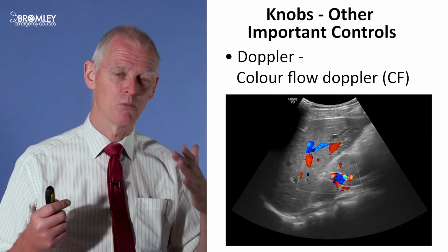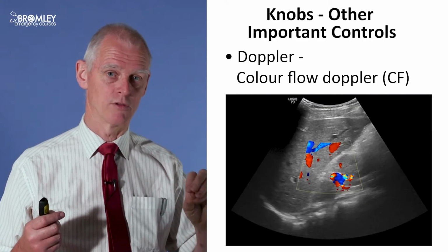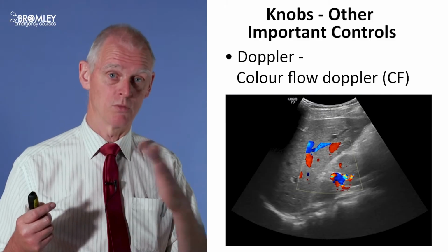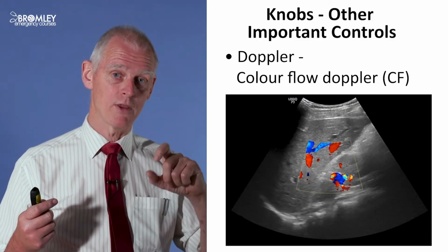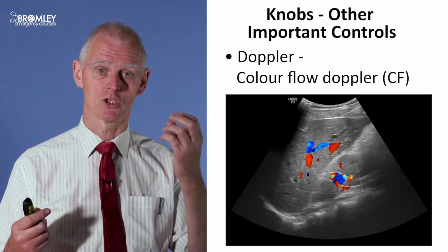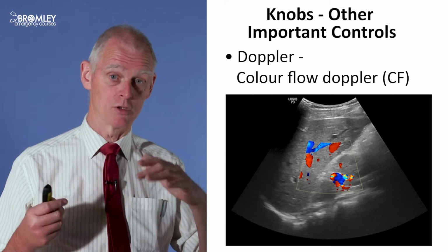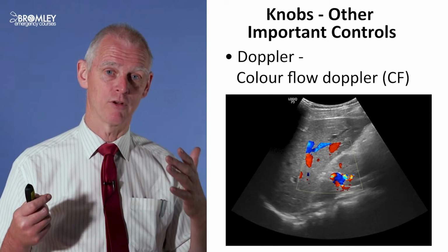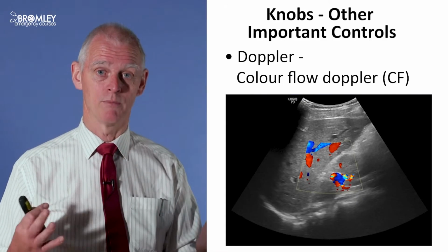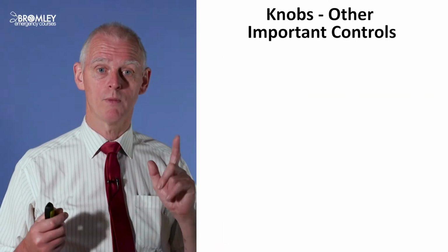One of the main uses is: is that a blood vessel? Can I look at the flow? If we're looking at it to decide if it's an artery or a vein, which is something we're often interested in, we don't go by the colour, we go by the character of the pulsation. Arterial pulsation has a distinctive character to it, whereas venous pulsation, of course, veins have variation in the flow, but it's more complicated because it's affected both by cardiac function and by respiratory function. So that's Doppler flow. What about other things?